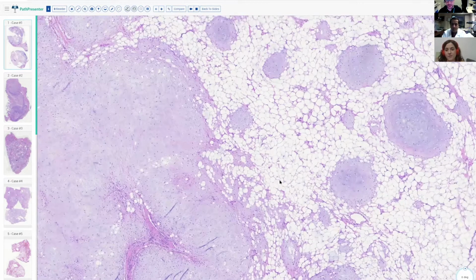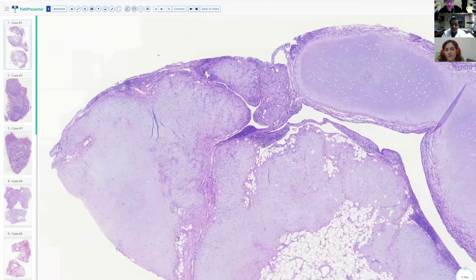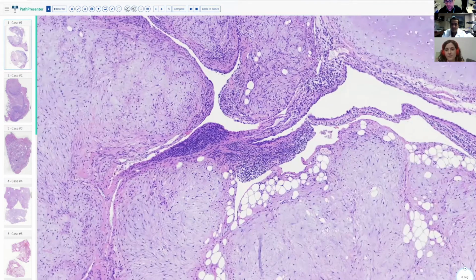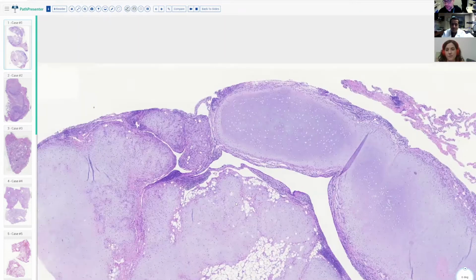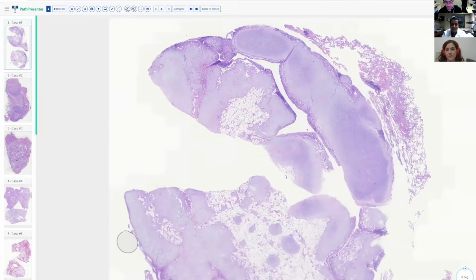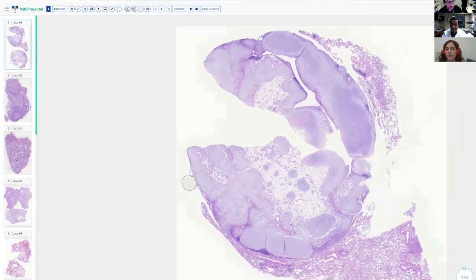A key point in these is that you can also get entrapped bronchial epithelium here, so don't get dissuaded by this and don't end up calling this malignant, right? So this is an important diagnostic feature of these as well. Anything you want to add for this, guys?